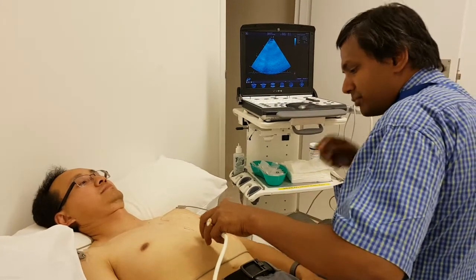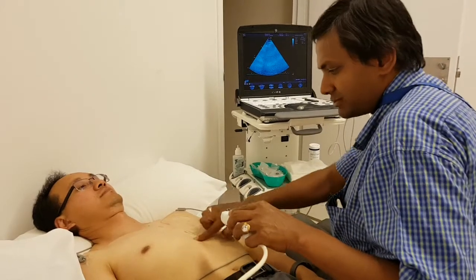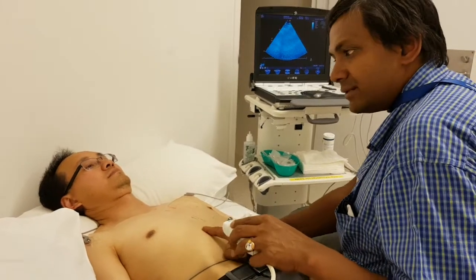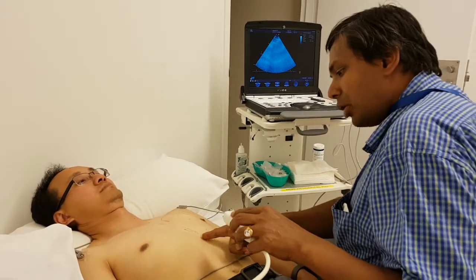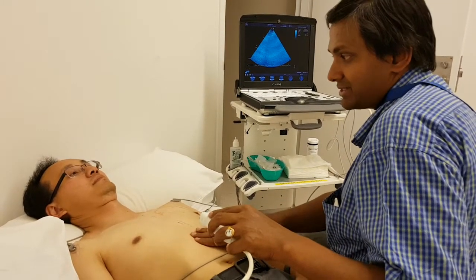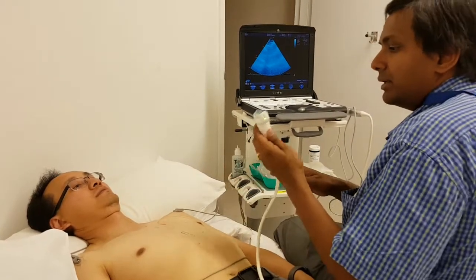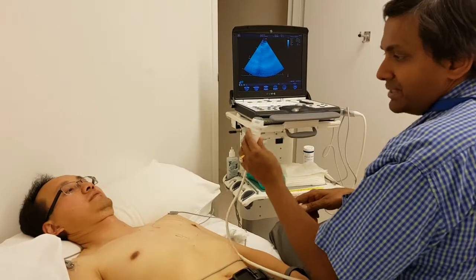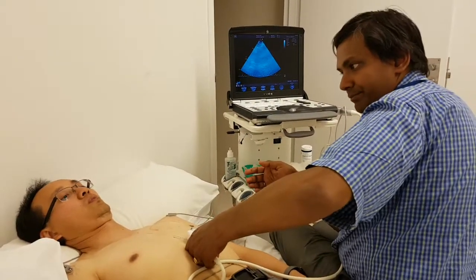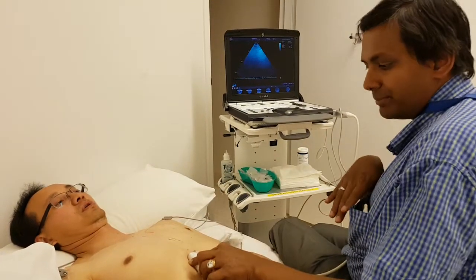With the subcostal, there is not much movement — you just keep the probe at the xiphoid sternum, just below that. You go slightly to the right side of the xiphoid sternum rather than the left, because on the left side you have stomach which may have gas, and on the right side you have liver which is vascular and allows the ultrasound beam to go through. You should not have any part of your finger under the probe, because you need to almost angle the probe on the patient's abdomen.